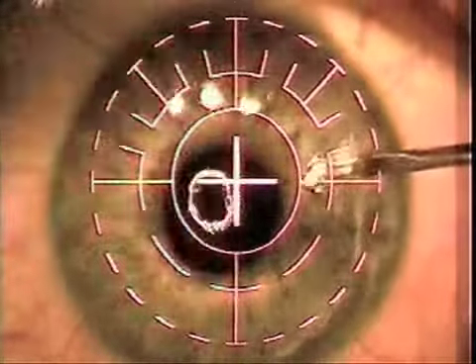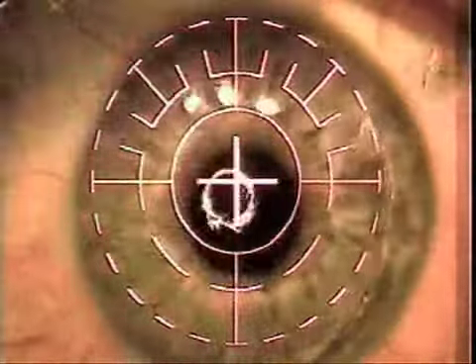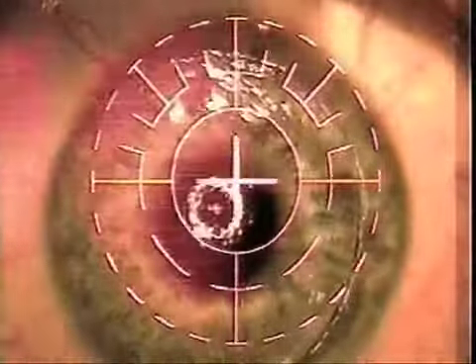What this does is, again, attempt to cleave the epithelium as sharply as possible in the periphery to prevent little tags of epithelium from becoming displaced or positioned underneath the flap. Then once the periphery has been cleaved with this SIBO flap lifter, the second end of this, which is a lamellar dissection tool, is used to break any central adhesions.